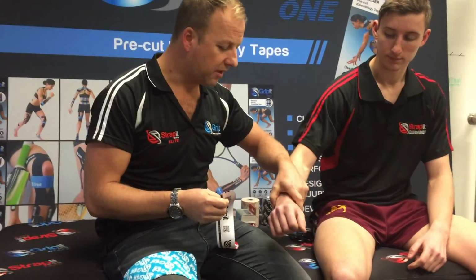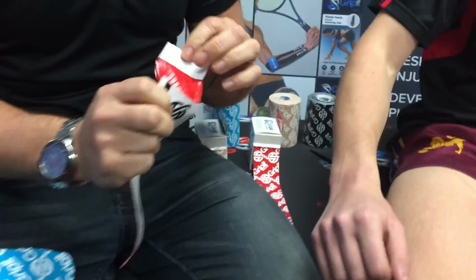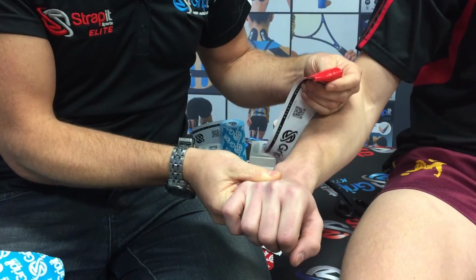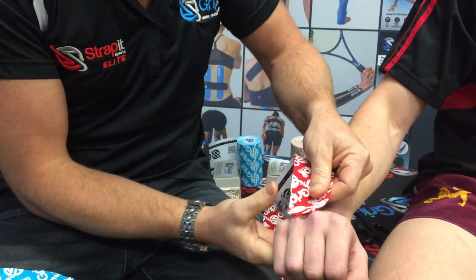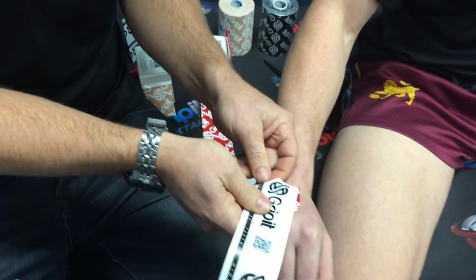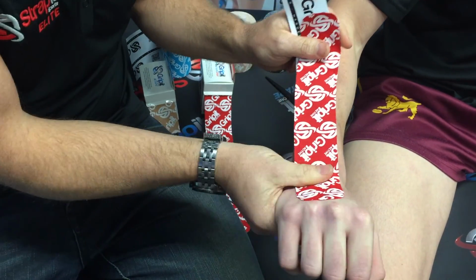Okay, so with Daniel here, who just popped in from footy training, we're going to go through a little taping technique. We're going to talk and show you this technique today. What's really important is that you use the advantage of the extensibility of the tape. Now, just as a quick demo, I'm going to show you two different ways to do the main longitudinal taping arm here of the Gripit Active.